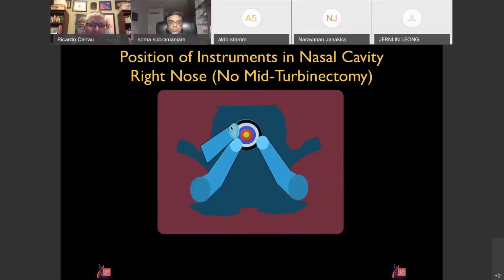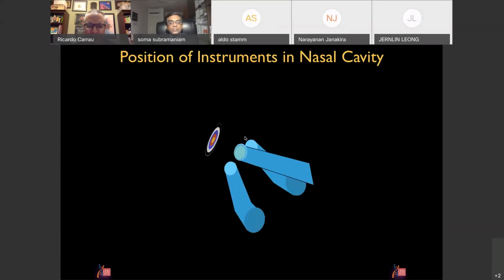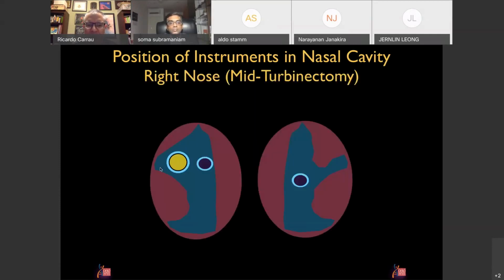for the space. So two ways of circumventing this problem is you can use curved suctions that come from a different angle as the scope, and that way you don't have that fight so much, or you can make a space for the endoscope. And this is why sometimes we have to remove tissue from the nose just to make that space. Again, we don't open the space to see. You can see through a very small hole.